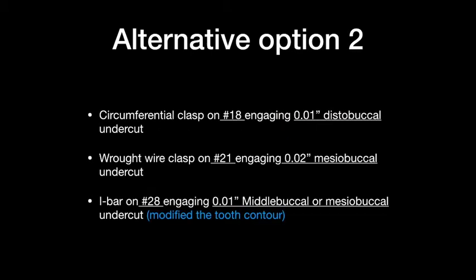Also, I haven't talked to you before. I said I will explain that today. So you can also do some modifications on the teeth. You can add composite to change the contour of the teeth, or you can make a survey crown to change your teeth. However, remember the KISS principle means that we want to keep it as simple as possible.